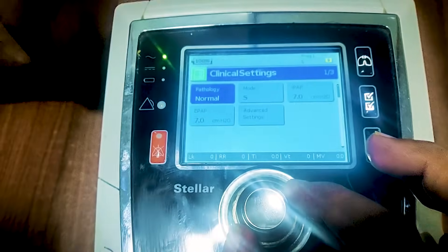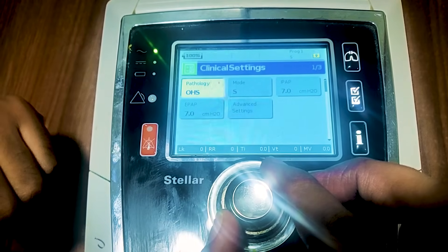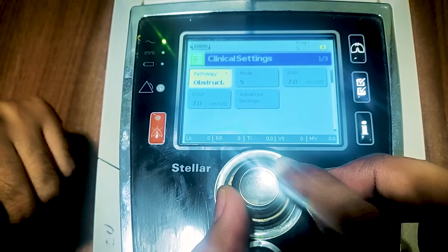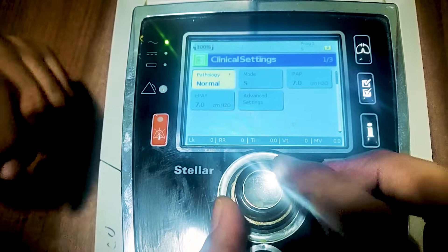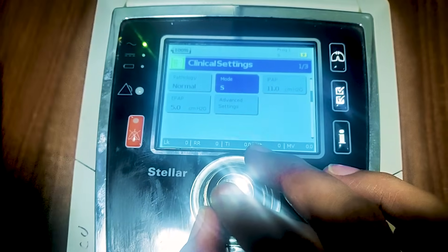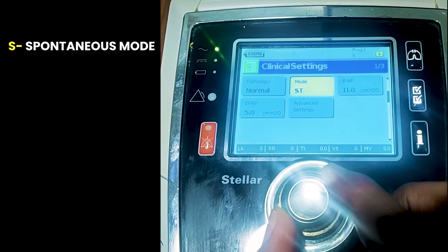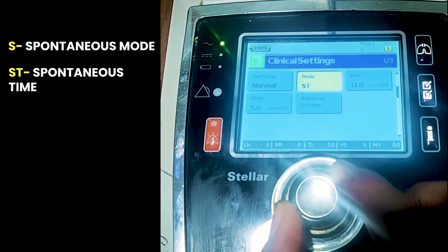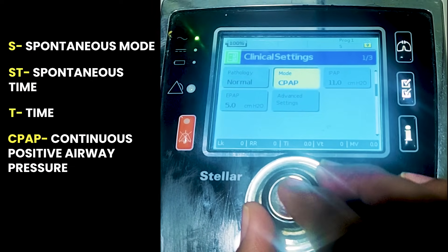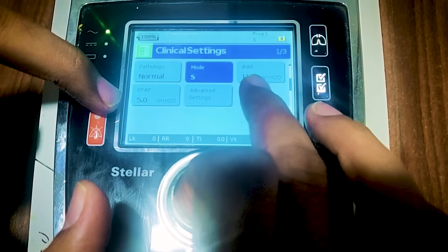Once unlocked, going into the settings: the first thing you can see is pathology. The machine asks which pathology — options include OHS (Obesity Hypoventilation Syndrome), restrictive disease, or obstructive disease. Select the pathology according to the patient. The other setting is the mode. You need to select the mode according to the patient's condition. The first mode available is S, which stands for spontaneous mode. Other modes are ST (spontaneous and time), T (time), and CPAP.